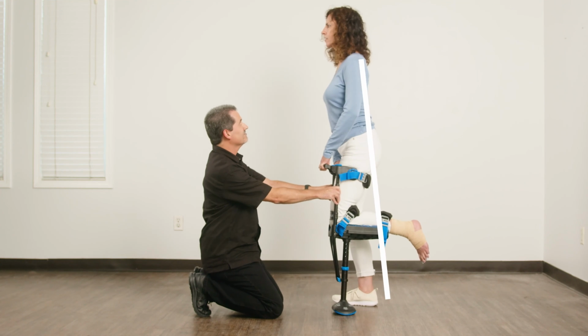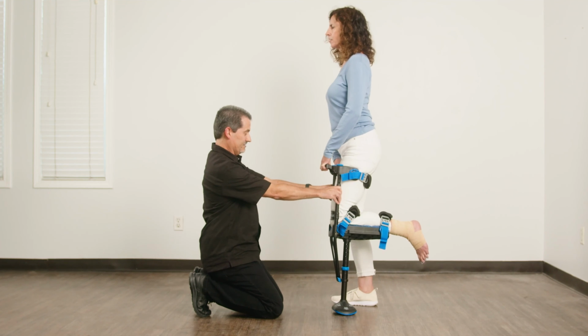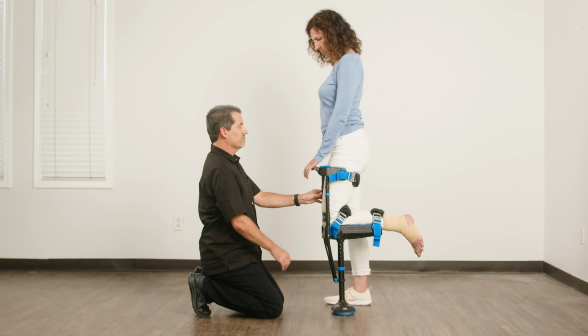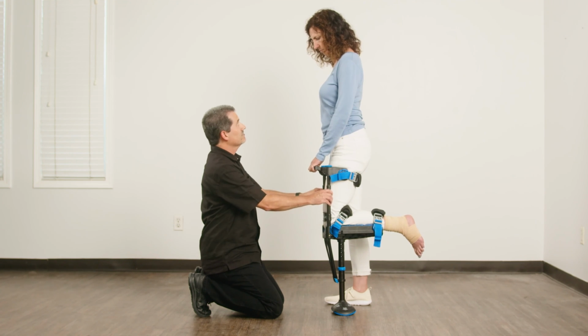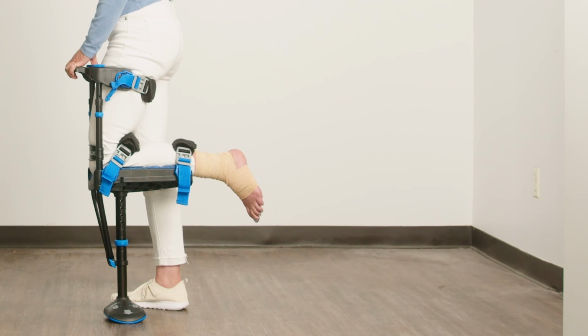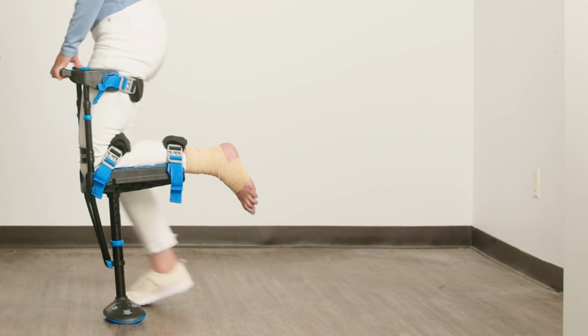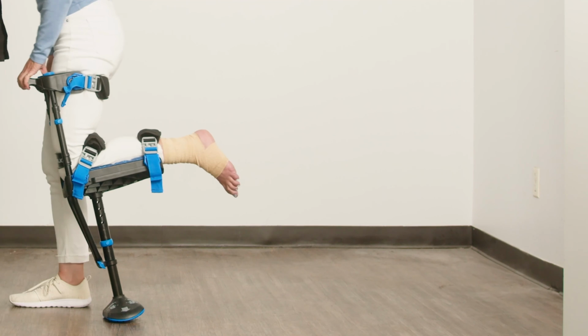That's how we walk. Have the patient step back to the starting position, feet side by side, hip width apart. Then repeat the exercise as many times as it takes for the patient's motion to become fluid. Now repeat the drill, but let go of the crutch to allow the patient to do it on their own with no assistance from you. Continue the exercise until the patient has fluid movement.